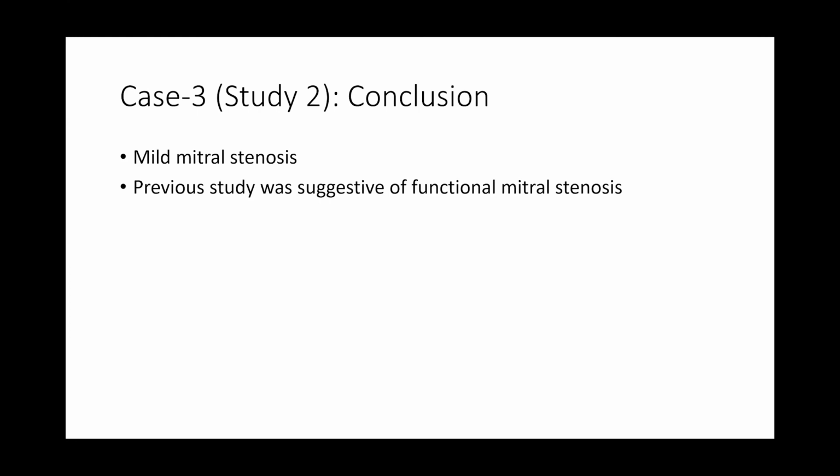In regards to hemodynamics, as we know with mitral regurgitation and preload and afterload dependency, when you do TOEs you'll get completely different numbers on systolic pressures and things. Anything to watch out for in mitral stenosis? Yeah, it depends what you're measuring. If you're measuring your mean gradient, then it has more effect from mitral regurgitation. But if you're talking about pressure half time, then aortic regurgitation is the main culprit. So it depends which parameter you're measuring.